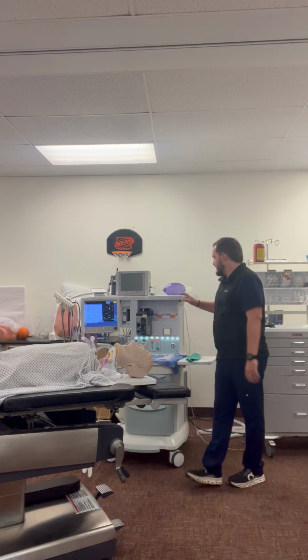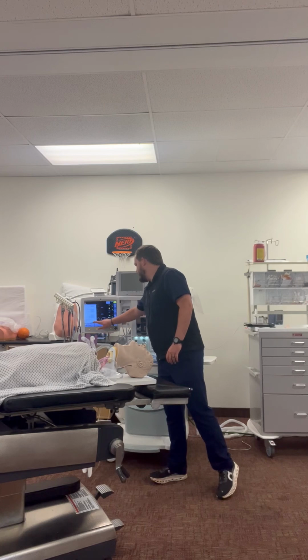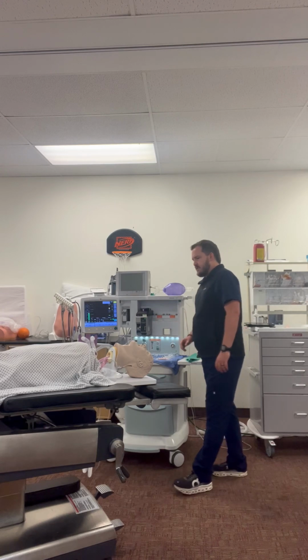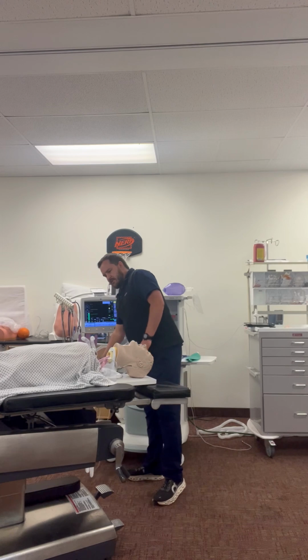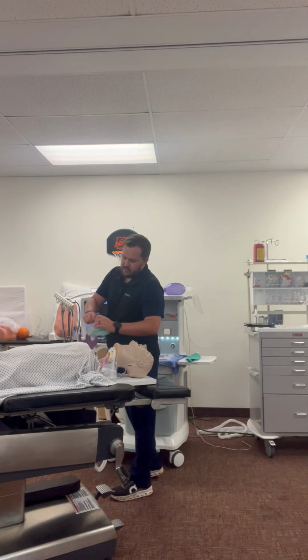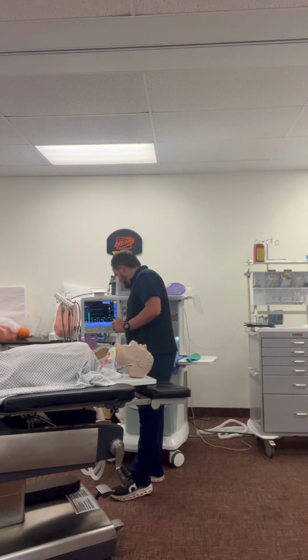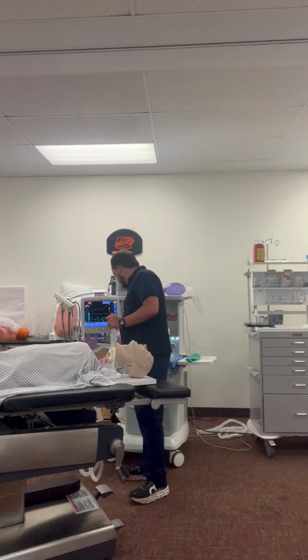Once I have my medications ready, I can go on, and now that my machine's on and ready to do the rest of the checks, I'll check my vaporizer, check my CO2 cartridge. I'm gonna make sure that the ventilator settings, like the alarms and everything, are working and on. My equipment is patent. I'm gonna perform a high pressure leak test. So I'm just gonna close my APL valve, and then I just need to get the pressure greater than 30. This will also check the high pressure alarm, make sure it's good for 10 seconds. And I'm gonna slowly open my APL valve back up, and the pressure should follow whatever I had the APL valve set to, so that works.